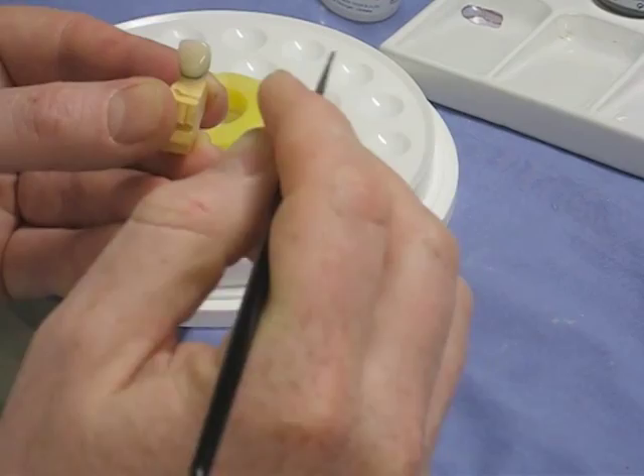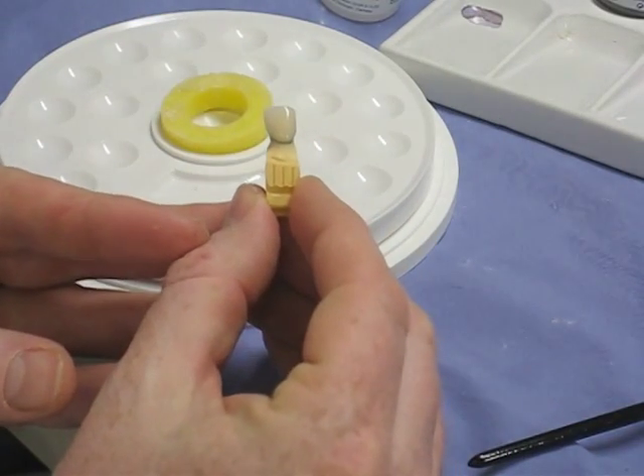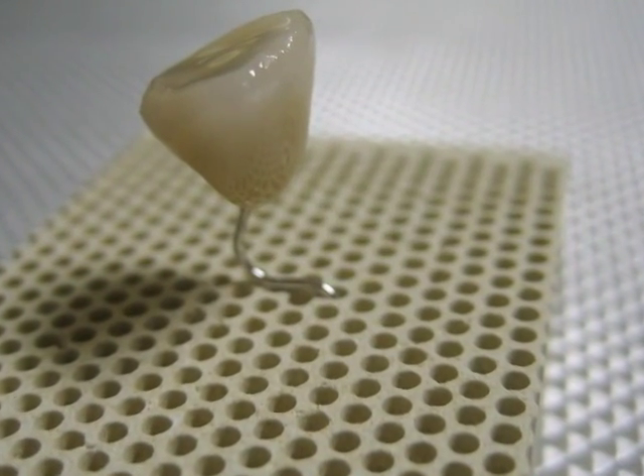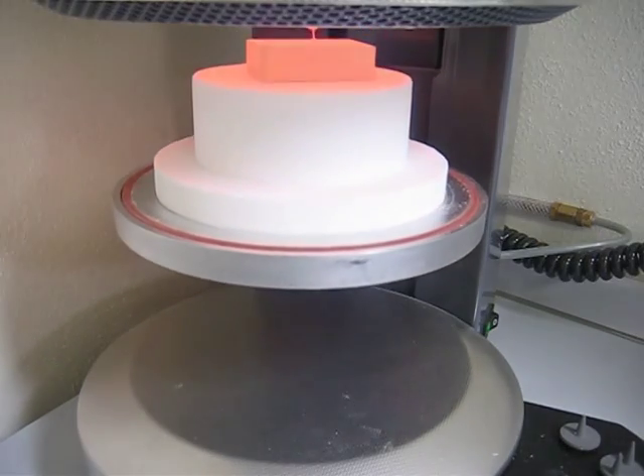If you have to adjust this crown in the patient's mouth one way or another, you're going to have to achieve a glaze again — either by having it re-glazed in the furnace like this, or by polishing it up, which isn't that easy.